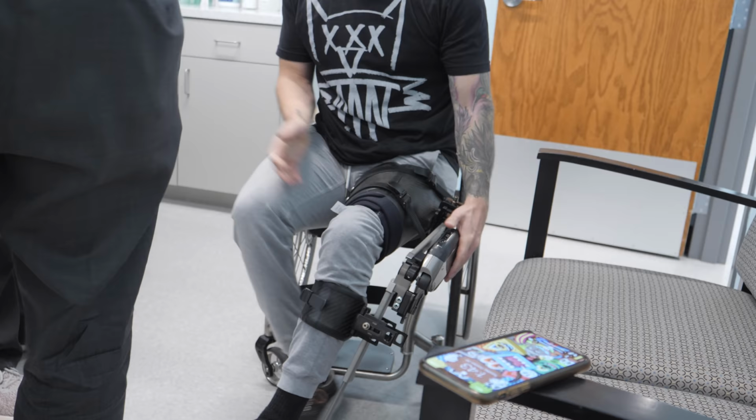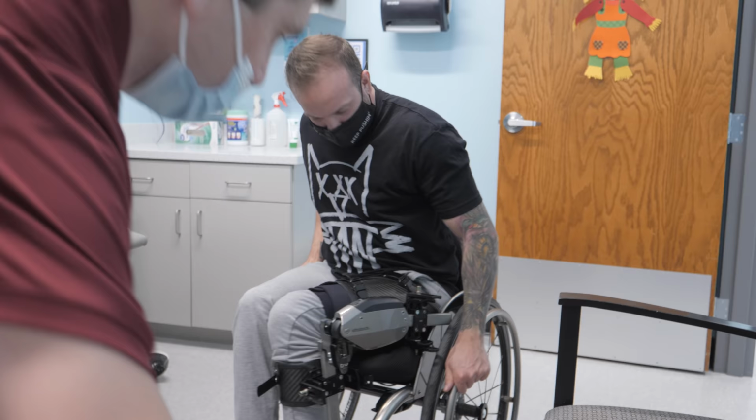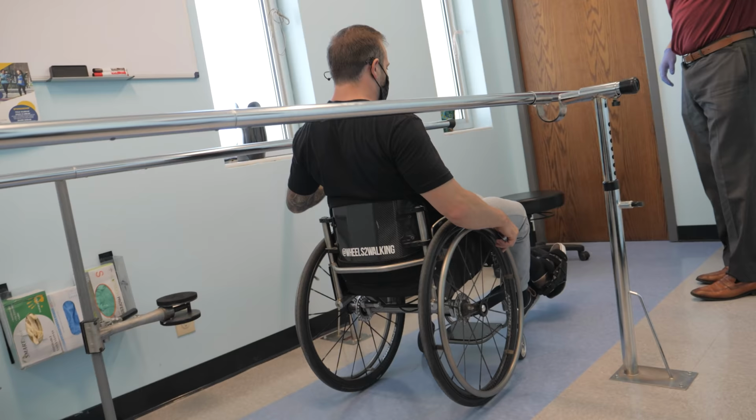You're going to feel some weight. Yeah. So that brace weighs about twice as much as the definitive. And obviously, yeah. One size fits nobody.